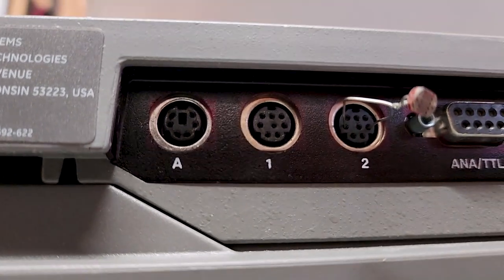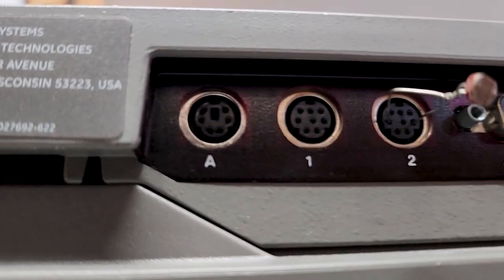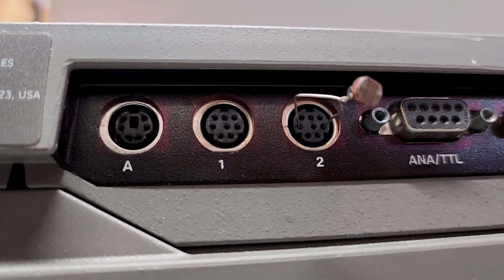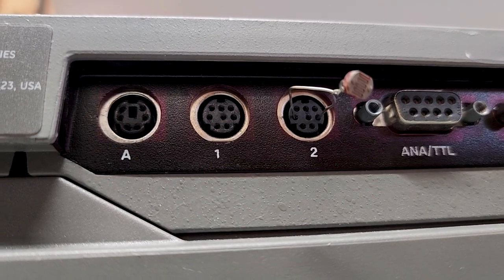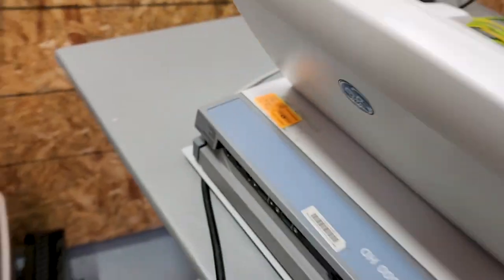These right here are mini DIN female ports — D-I-N. You can find the pin out for them. Ports 1 and 2 are mini DIN females — eight-pin mini DIN females. Now I'll just remove that jumper. My port is absolutely fine.